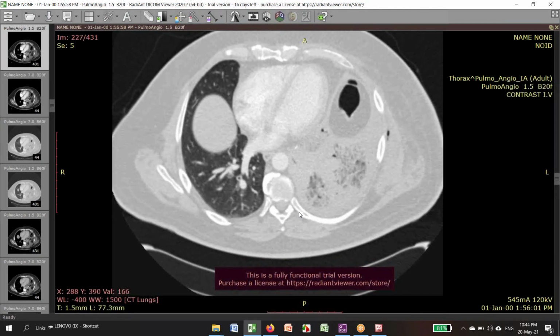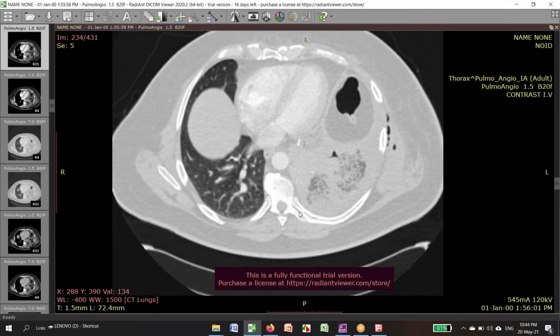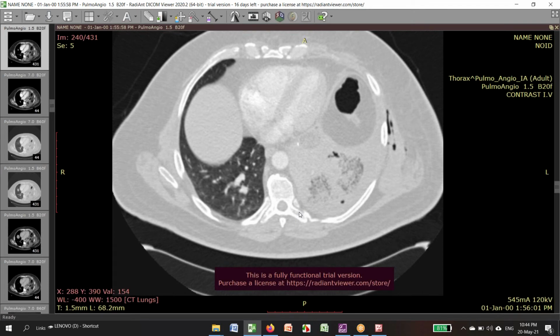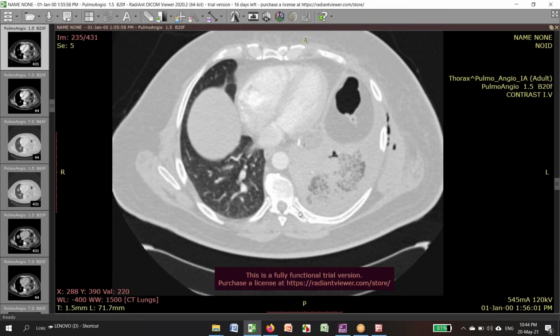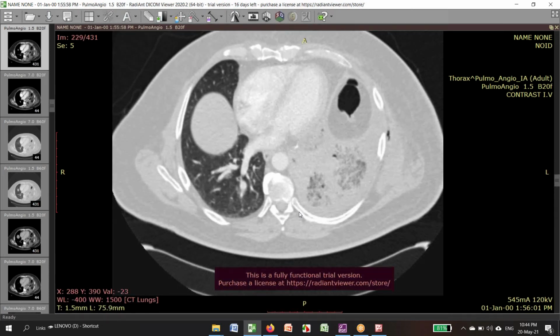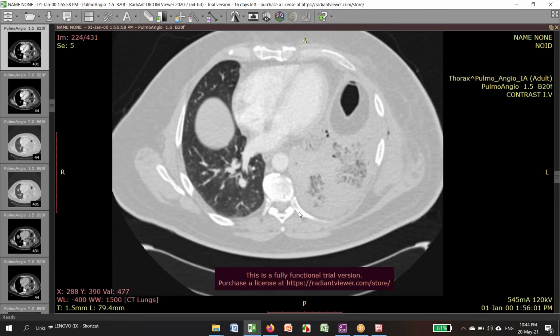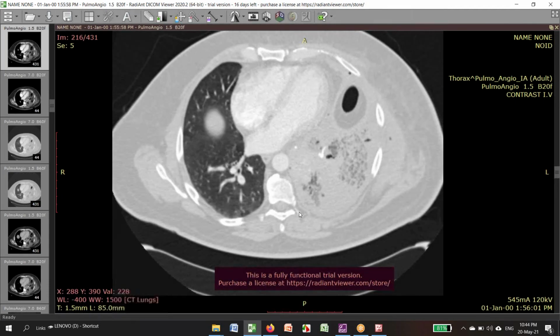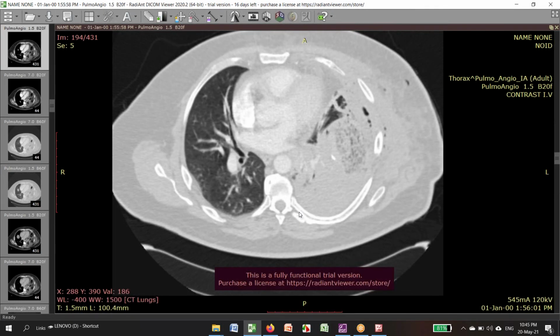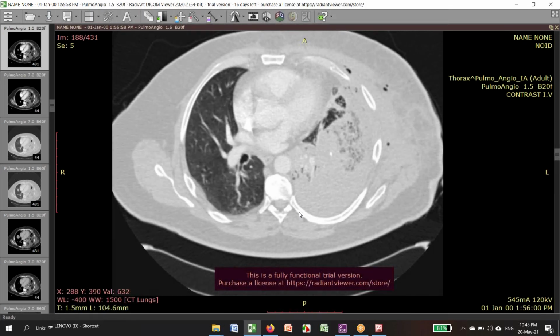You see it over a few days on the postoperative imaging, that remaining lobe or lung becomes denser and often expands outward. And that's what you see sometimes with torsion. You'll see the fissure move, but you don't see it immediately postoperative. You see it typically, I don't know, a couple days later as it starts getting more and more plugged up and expands out. And then probably what happens is the pressure is so great that the inflow and the outflow prevents any inflow, and then you get that venous infarction like that. And that's why on the path image you showed, the gross specimen, it's so red and just engorged looking.